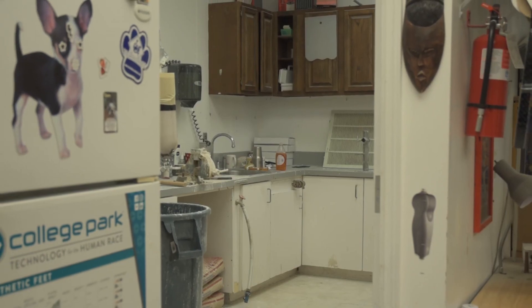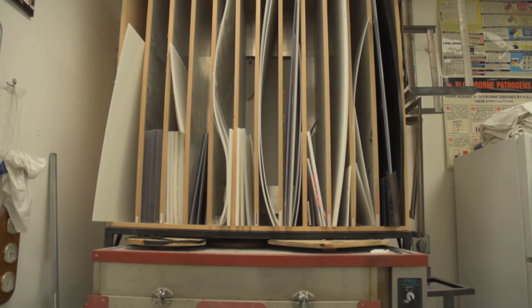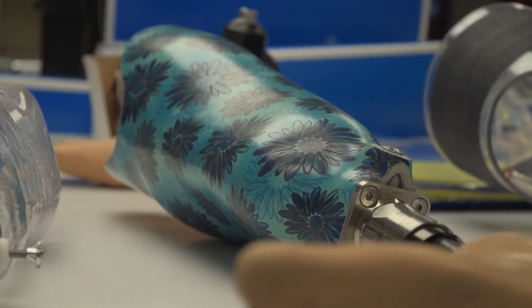The test socket gets filled again with plaster. I'll do any modifications needed from the test socket, then put it in a lamination stand, which is what we use to pull the plastic. The last layer was a fabric — just a cotton fabric — that would be the last layer that goes on it. Once I pull the resin down in there and string it out nice and smooth, within about 12 minutes the lamination will harden and then I can cut and grind it to get the completed socket.